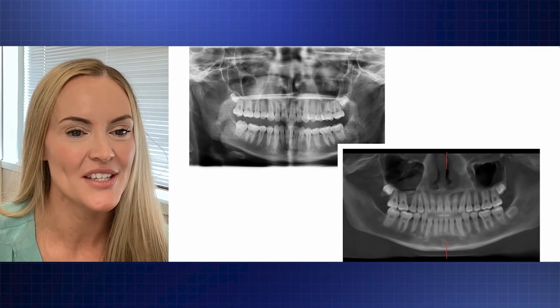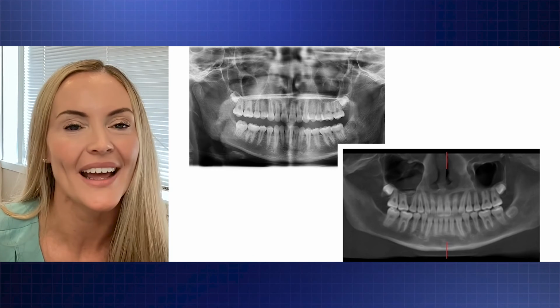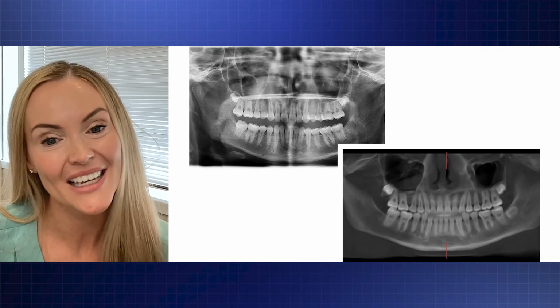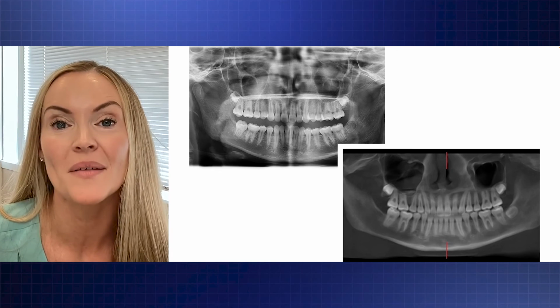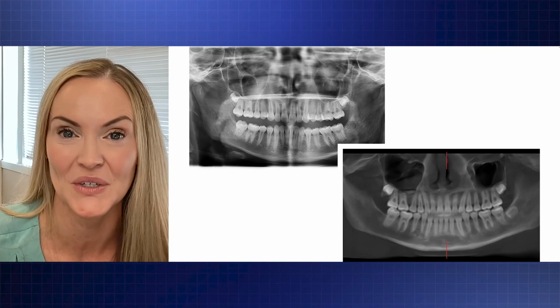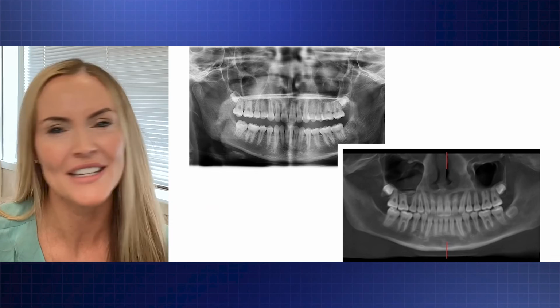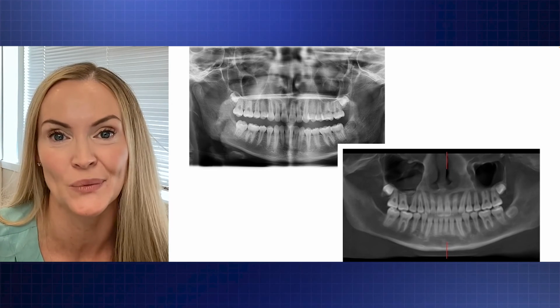Notice the patient's initial panoramic x-ray, how parallel her roots were, and look at what excellent root control I had with my root control attachment, but it's an unwanted side effect. It was a root movement that I should have removed from my treatment plan, my digital mock-up. So be sure to look at the angulation changes on your posterior teeth. If it makes sense to keep it, then keep it. And if it doesn't make sense in your treatment plan, then make sure you take away unwanted root movements.